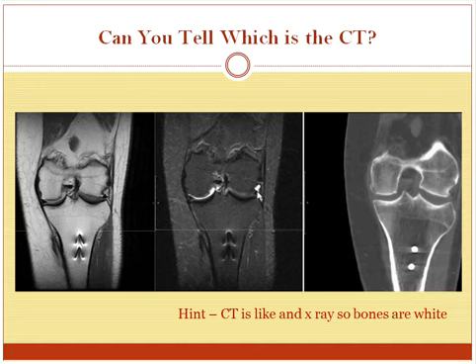Now this is MRI, and MRI can look different depending on the sequence. Here, marrow is really bright, fat is bright, and in this one, fat and marrow are really dark. And fluid is bright here, a little cleft of fluid.